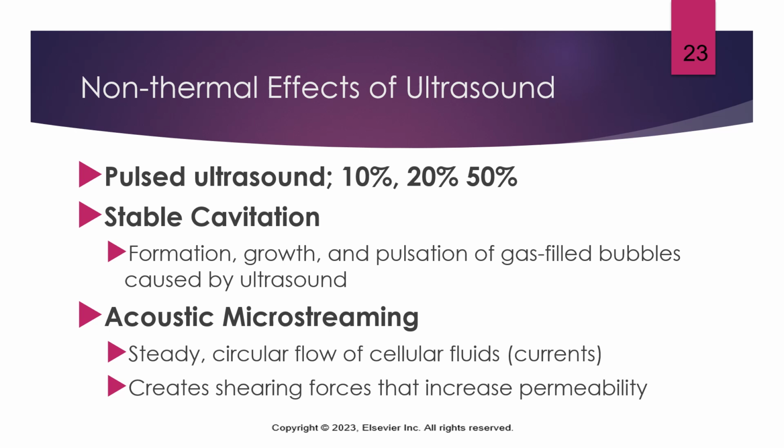So non-thermal ultrasound is all about increasing cell permeability and getting that exchange of nutrients while getting rid of that metabolic waste in the tissues. We're trying to facilitate tissue repair by enhancing these cellular processes.